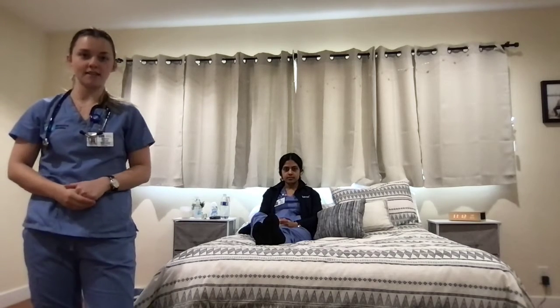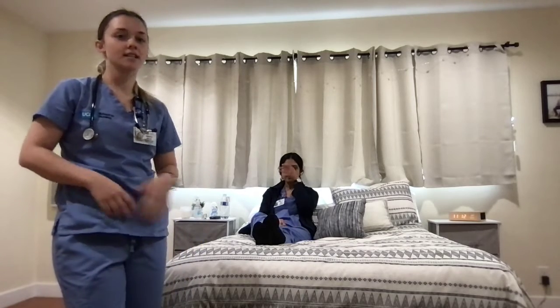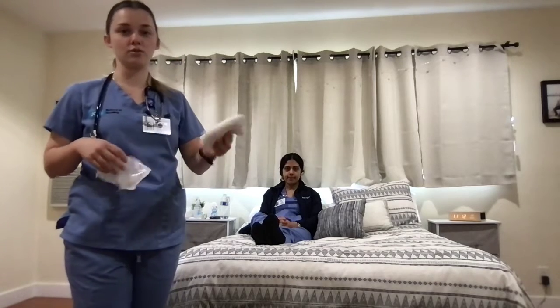This is my OSAT for post-op exercises. To start, I will speak and communicate in a professional manner. I'm going to check the provider's orders, gather my supplies and my stethoscope, my incentive spirometer, and my tissues for coughing.